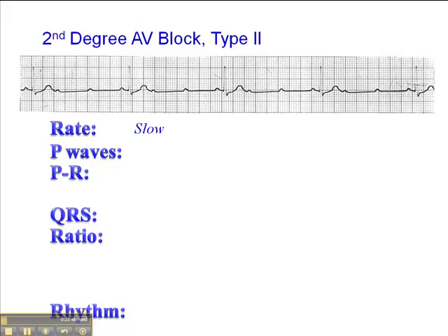Transcutaneous pacing is considered the gold standard for a hemodynamically unstable second-degree AV block type 2. So the heart rate is a little bit concerning typically.